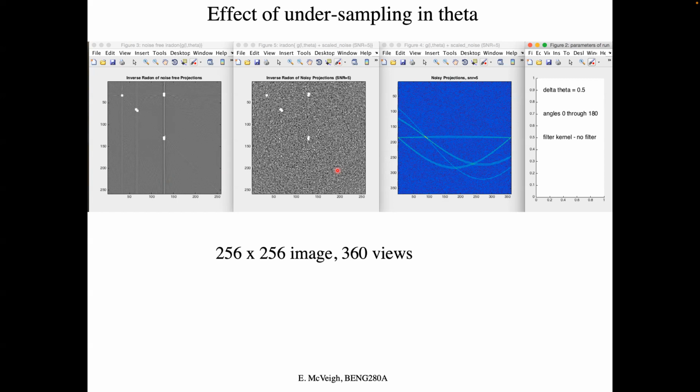That is possible, because the way the data is collected is the X-rays are turned on and the gantry rotates continuously and the sampling occurs continuously in time. It's not like we're stopping the gantry, taking data, stopping the gantry, taking data. So if we up the time rate of our sampling, we could get many more views.